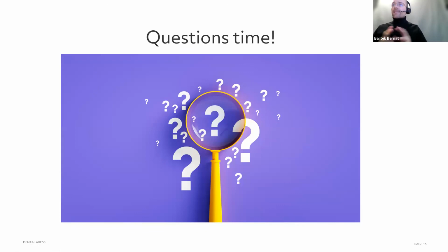Yes, that's a great question. Normally, what I did scanning intraorally is a model, obviously, but I may not be able to get that. So then I would choose option number 2, which is make a traditional impression, do all the moves that you need to do, and scan the impressions if you want that. Obviously, it probably needs to be case related.